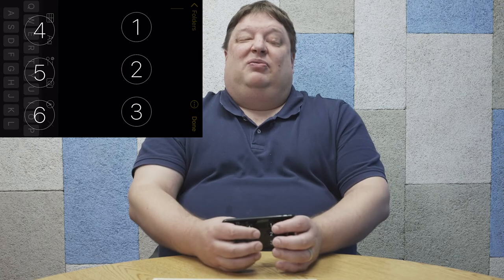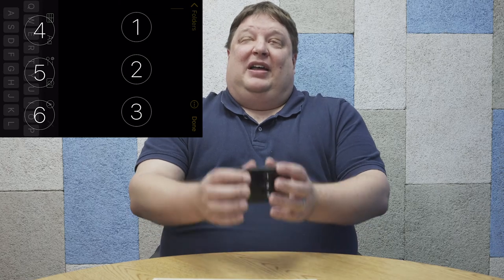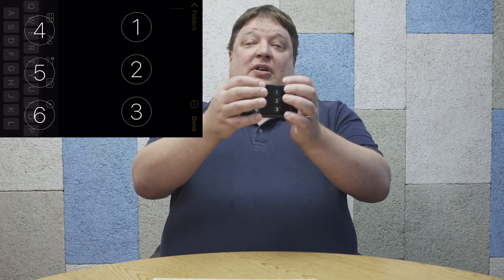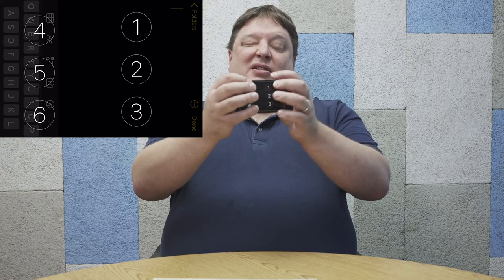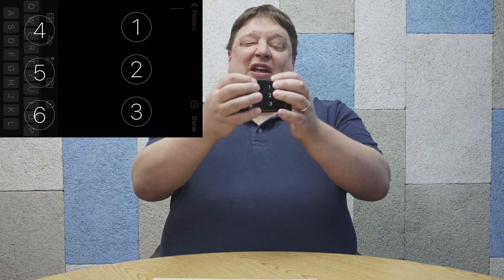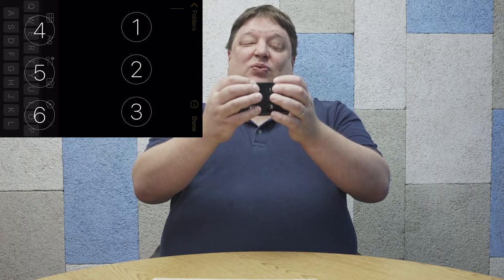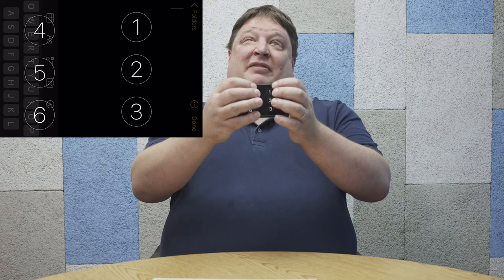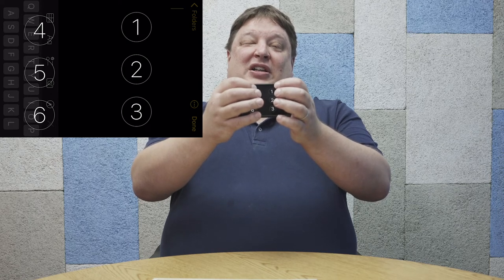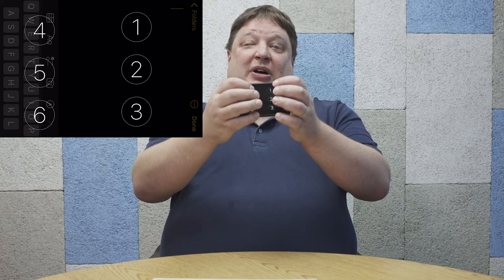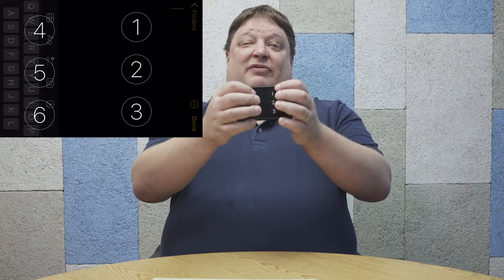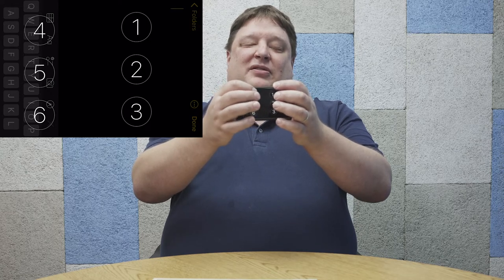When I hold the device like that between my two palms, my left hand fingers are on dots one, two, three from top to bottom, and my right hand fingers are on dots four, five, six from top to bottom. So when I want to write Braille, this is what I do.